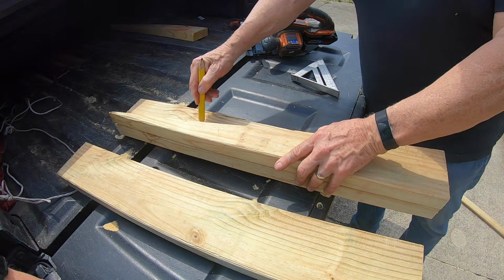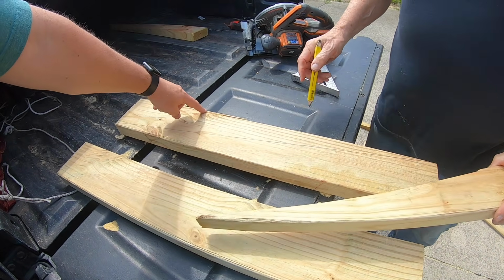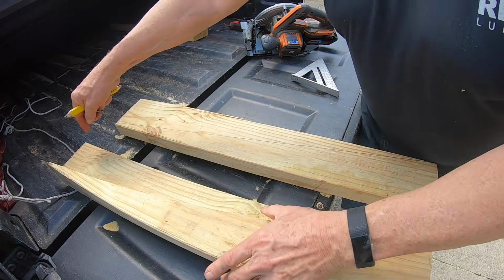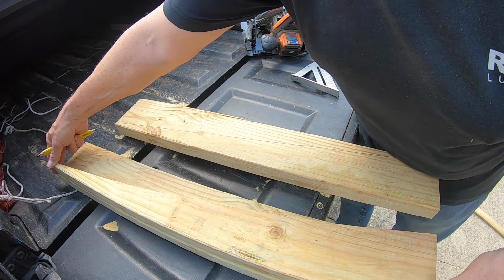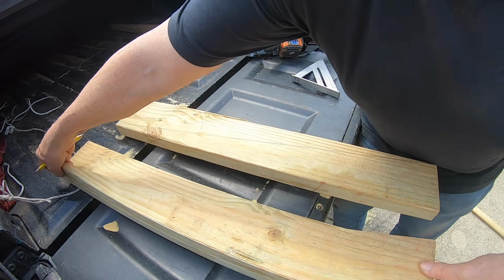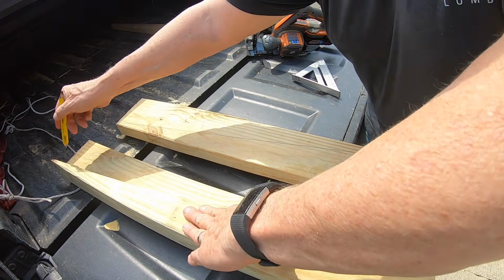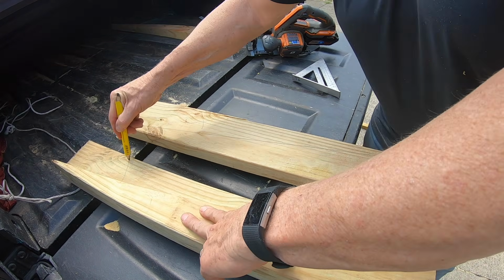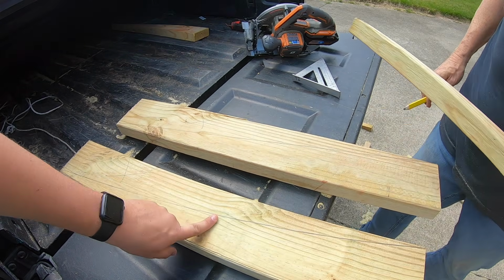And the same thing, if you do have any kind of bad piece of wood, like this was not a perfect cut on this side, go ahead and throw that piece away and use the other piece. Mark the side you're not using, so you can easily see which one is your scrap. And so go ahead and mark that side as well. And that will give you the 2 lines that you need right here and right here.